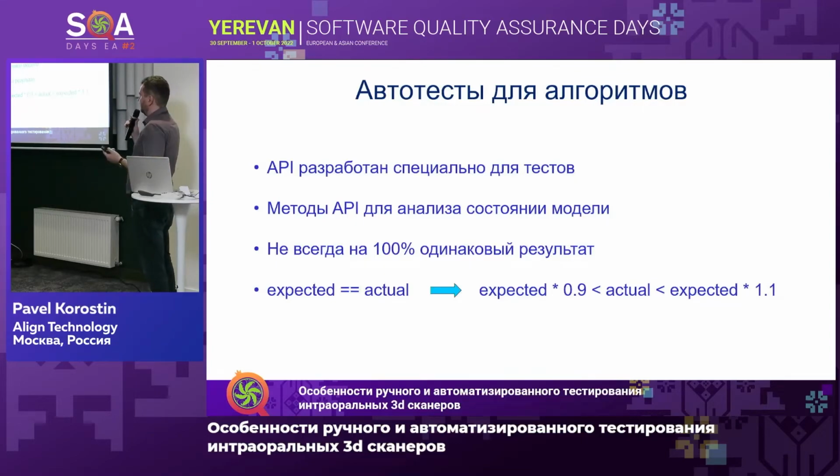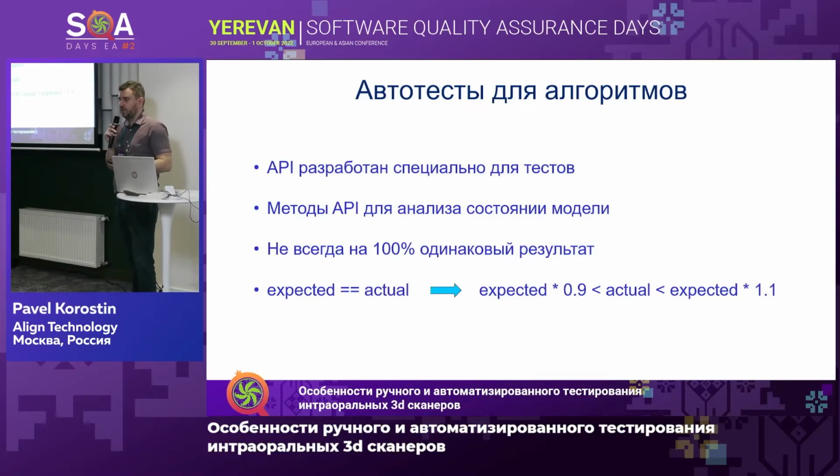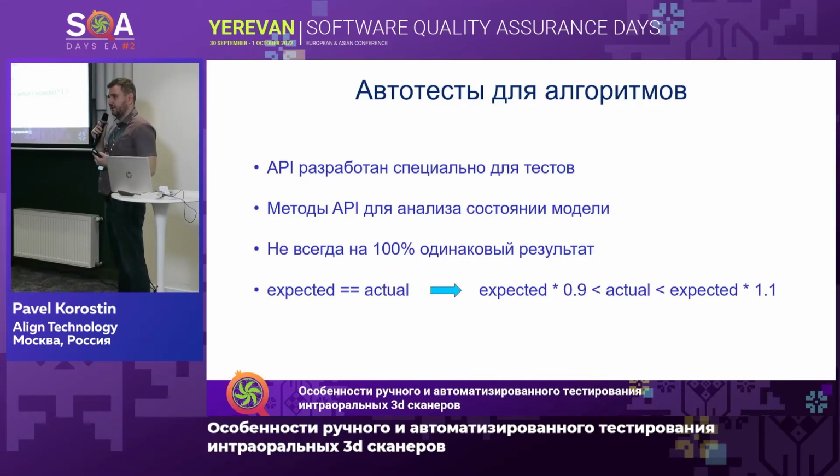We have decided to add to the special testing sets a program interface which could be actively used in the tests. We don't have it natively because it's physically impossible to connect it through an API. As we have seen in testing the algorithm, the validation method we use mostly is visual. So in order to upgrade it to the program level, we have added some methods to get the current status of the model.